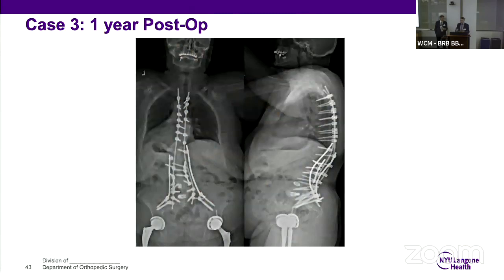If I'm going to do TLIFs, interbodies, osteotomies, I don't do that right away. If I need to do a lot of work, I'll place headless screws, then work around the headless screws. The headless screw helps me mark my anatomy. I'm no longer navigating at that point, really, or relying on the navigation. And then when you want to complete the T4, you do it staged, you expose it staged, so the patient's not bleeding from an entire wound the whole case.